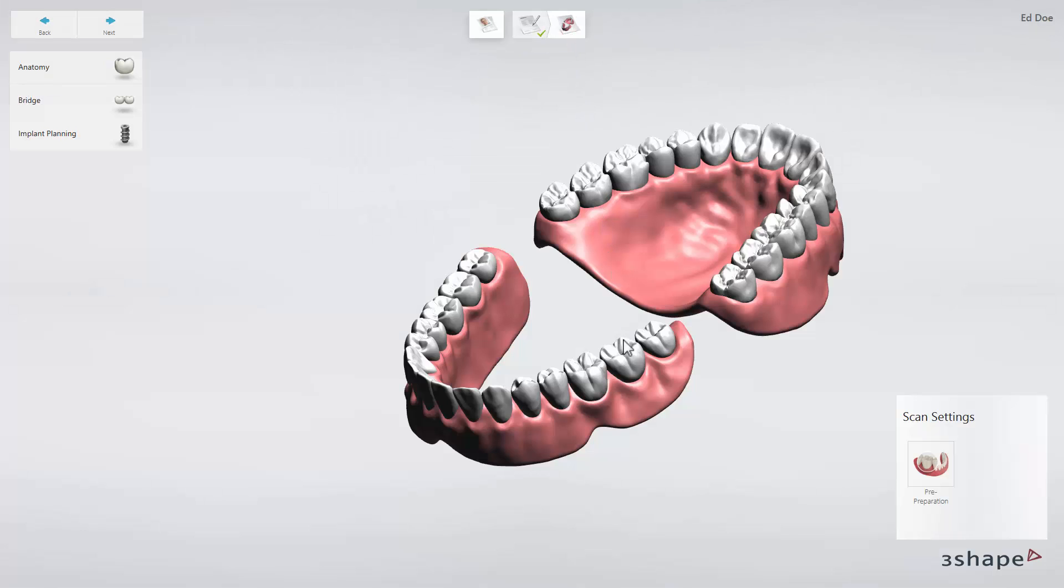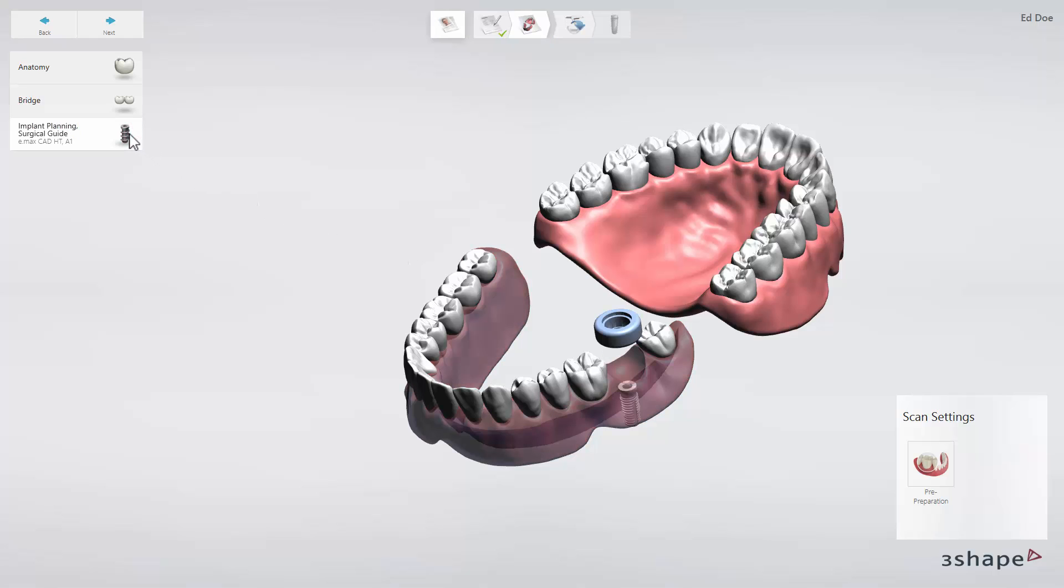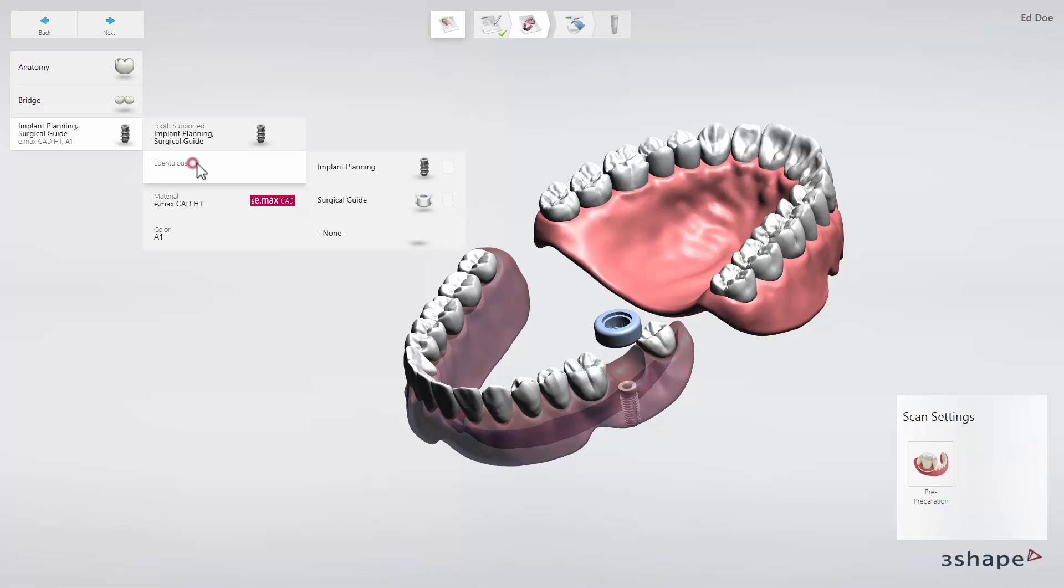Choose a single tooth and click the Implant Planning tab. In the drop-down menu, choose Edentulous and put a checkmark for Implant Planning.